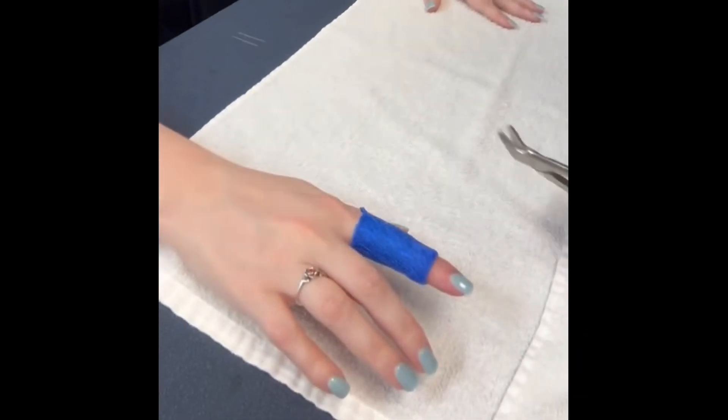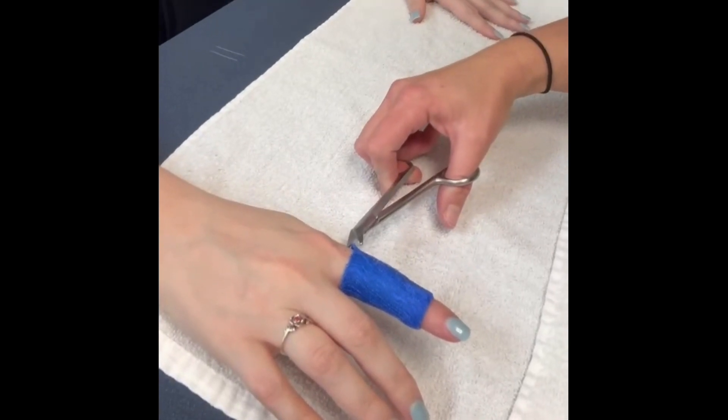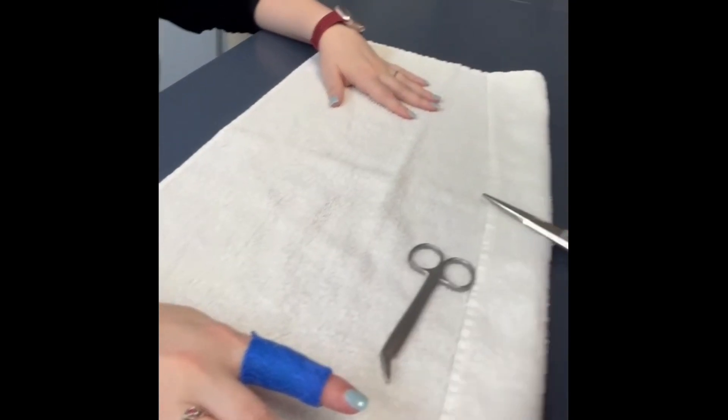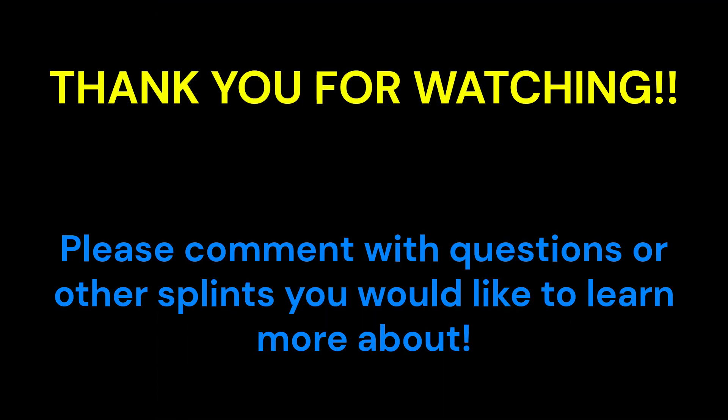Use your small blunt-edge scissors to cut and round out any sharp edges or to make any adjustments you may need. The splint should be worn for one week if possible for the best results. Have your patient come in weekly to measure improvements with PIPJ extension and to change the splint, while also checking the skin for any irritation or redness.